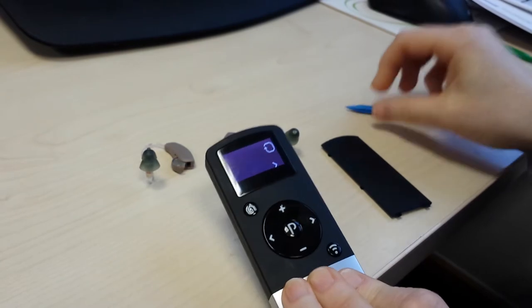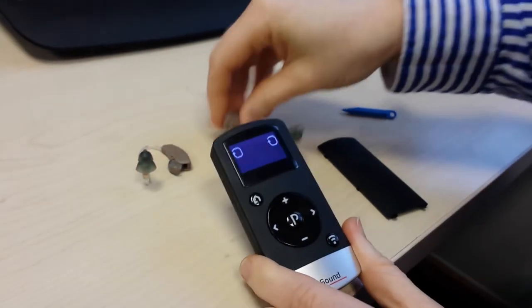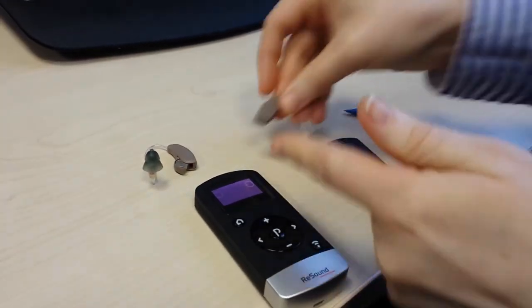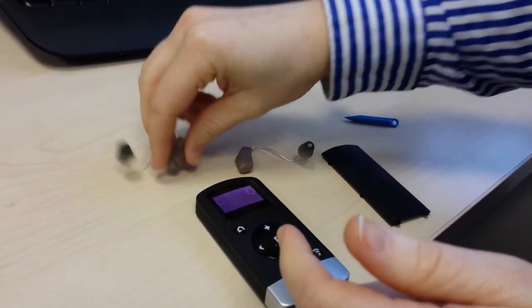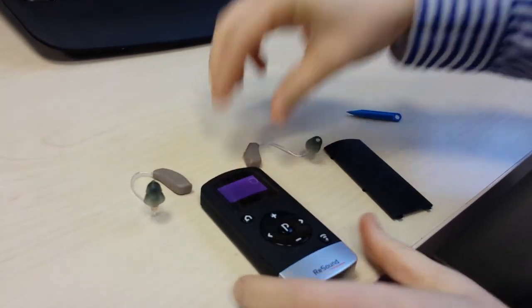The remote control will now be looking for the hearing aids. Simply close the battery doors on both instruments and wait.